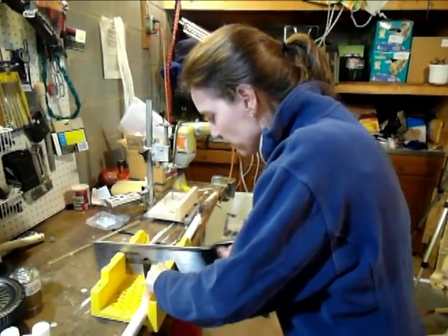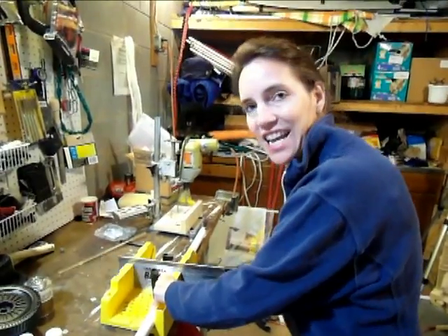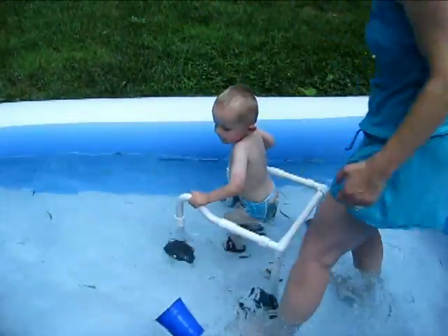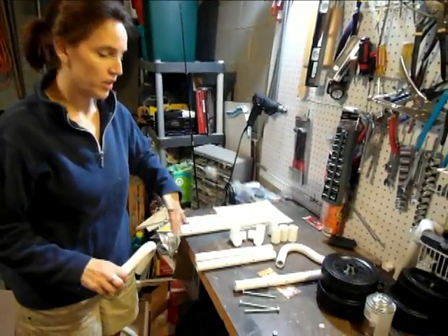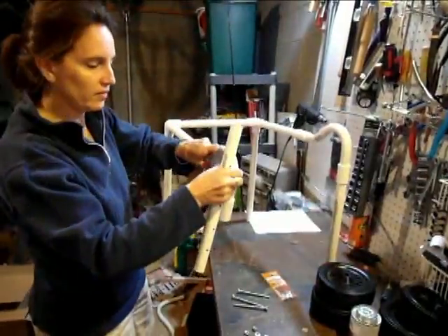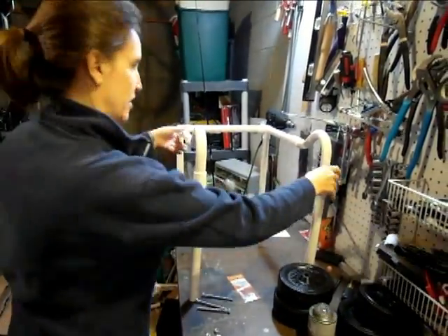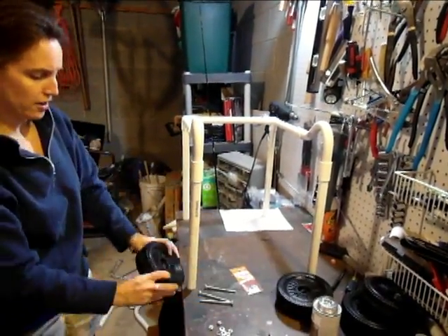How long does it take to put one together? As long as you have all the parts assembled, it doesn't take much longer than an hour. You'll notice the walker has holes in it — that's because we're using the walker in a swimming pool, and the holes help the water to leave so the walker doesn't float. We've got everything cut out and the holes drilled in the different pieces, and now we're going to dry fit everything together and get it in the right form. I'm getting this last leg in here and making sure everything evens up, that it all lines up, and then I'm going to put the wheels on.